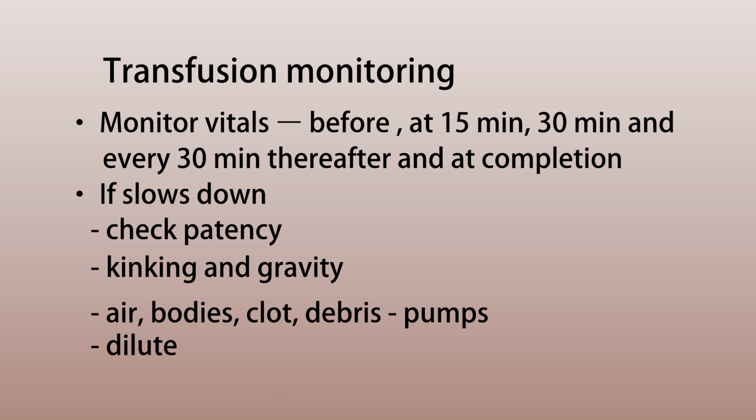And once you connect the blood set, you have to monitor the transfusion. Ideally, initially you start the transfusion very slowly. The reason is, it's known that most of the reactions to blood products usually happen within 20 to 30 minutes after starting the transfusion. And it is said that whenever you give a mismatched or wrong blood, when the amount of blood transfused is less than 50 ml, most of the time you will be able to revive the patient. So when your transfusion rate is very slow initially, even if some mild reactions happen, it's easy to revive the patient.